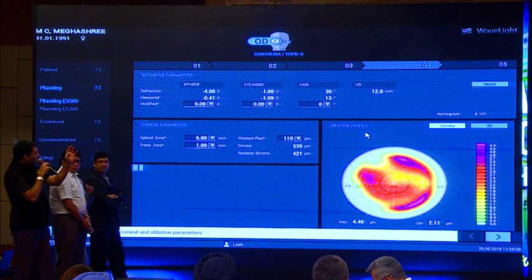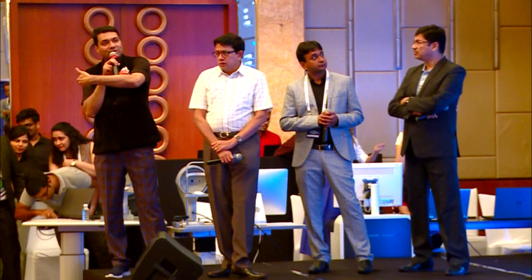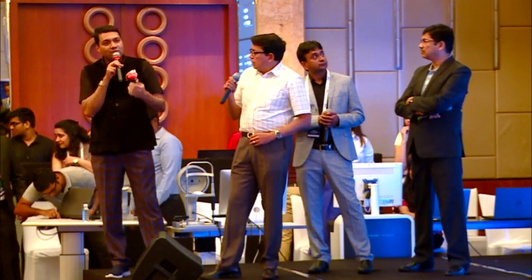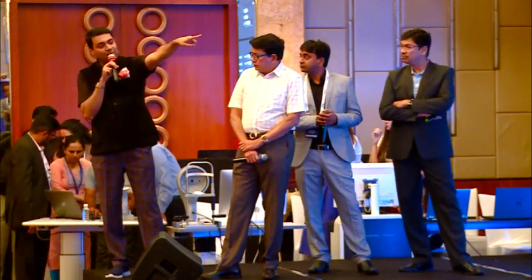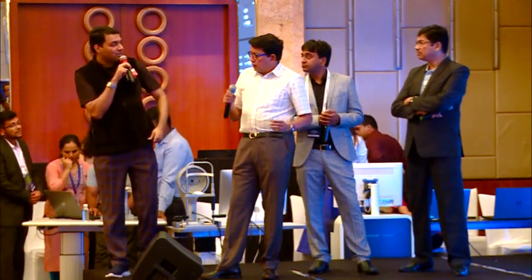So what happens is when your cylinder component is small, they match very well. Only the axis changes. The axis you have measured was 13, but probably if the pupil increases, like I just showed, the axis may be something else. But one of the take-home points is if you go back to this 0 rule and you see that a lot of aberrations are there, and you go to the Zernike pyramid and you feel there are aberrations that go more towards the topolyser axis, I think this is a kind of case which would typically benefit from a CONTOURA treatment.